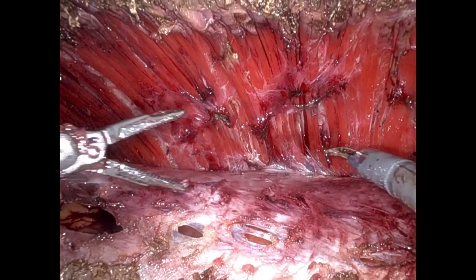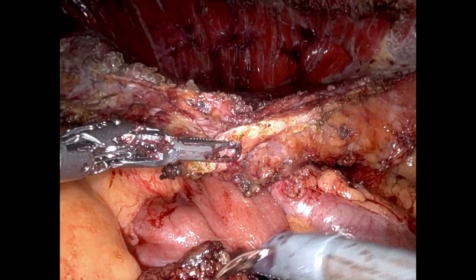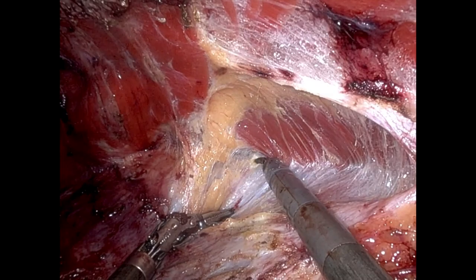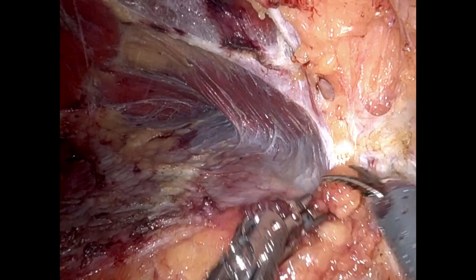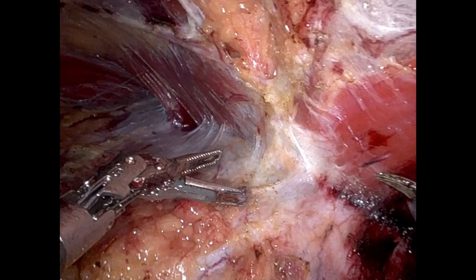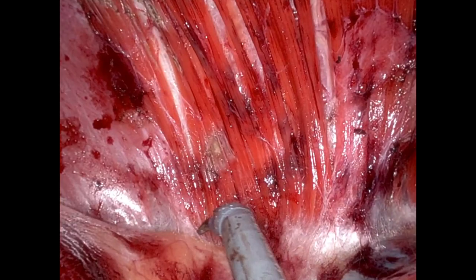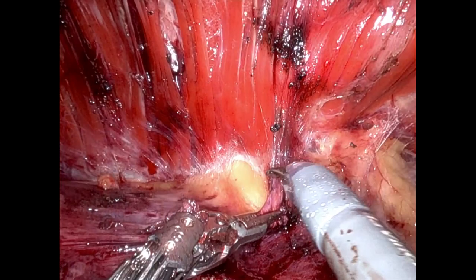This process went pretty straightforward — a few holes in that posterior sheath, as you can see, but very easy to repair those. At this point we have good medialization of our posterior sheaths. Now we're going to do the subdiaphragmatic dissection on the contralateral side, aiming to develop a space and expose the central tendon of the diaphragm. This is a critical structure when performing hernia repairs for EHS M1 hernias. Here you can see the central tendon, and we've done an adequate dissection.